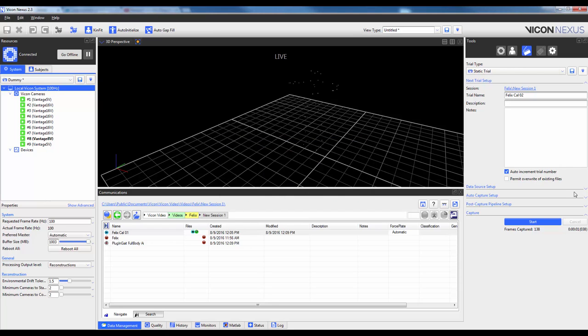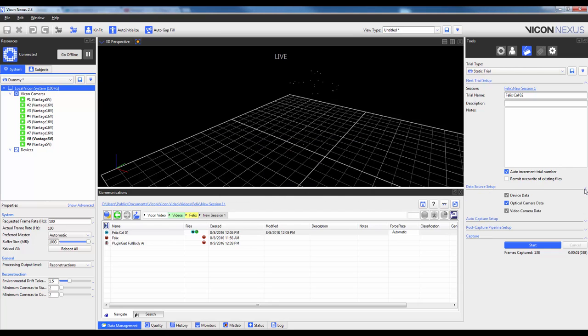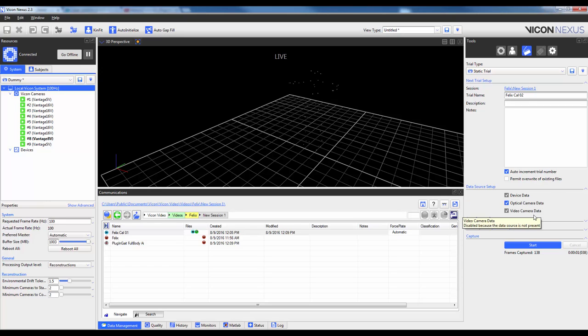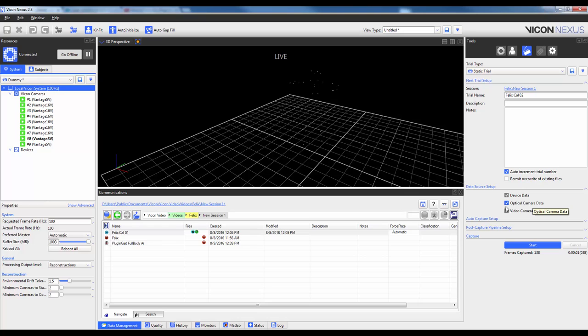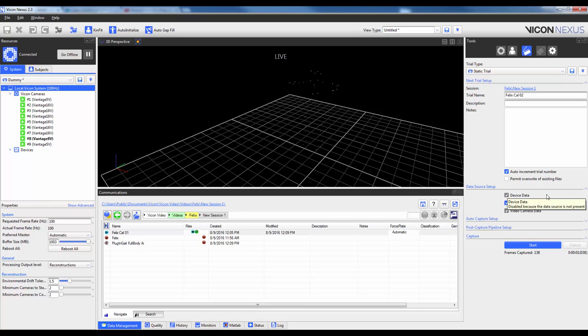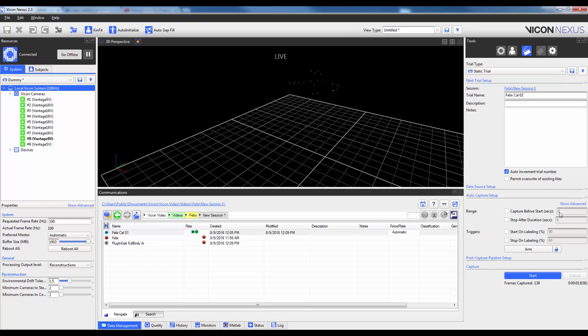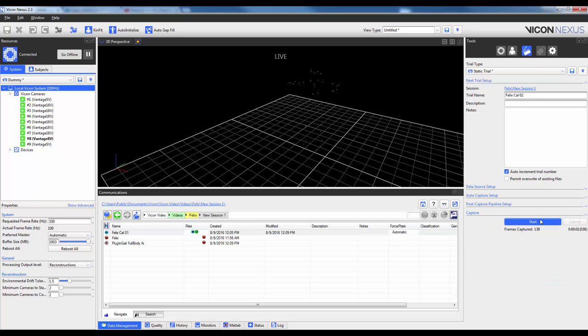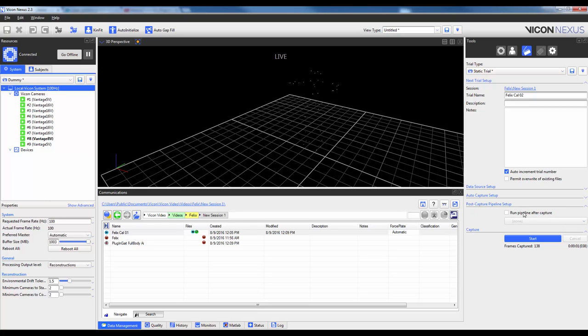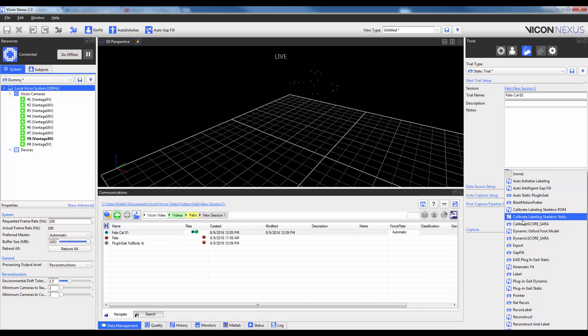So now I have the options of selecting whether or not I want any force plate data, EMG, or video camera data. In this case, I only have optical, so that's the only one selected, but I can deselect them should these actually be in my system file. As I only really need one second of data, I'm going to go ahead and tell it to stop after the duration of one. And then under my post capture pipeline setup, I'm going to make sure to run a pipeline this time, and I'm going to go ahead and select the one that I just created, which is auto-static plug-in gate.